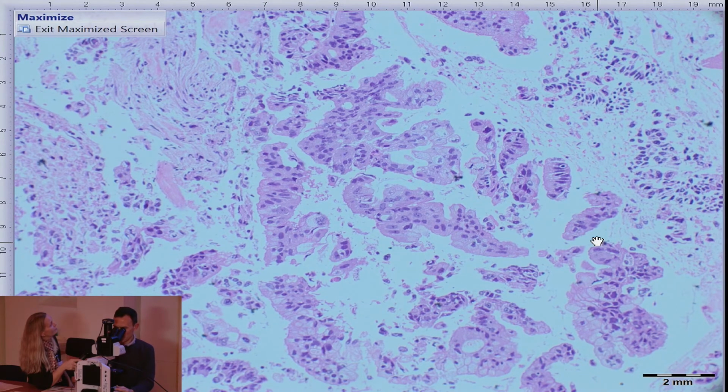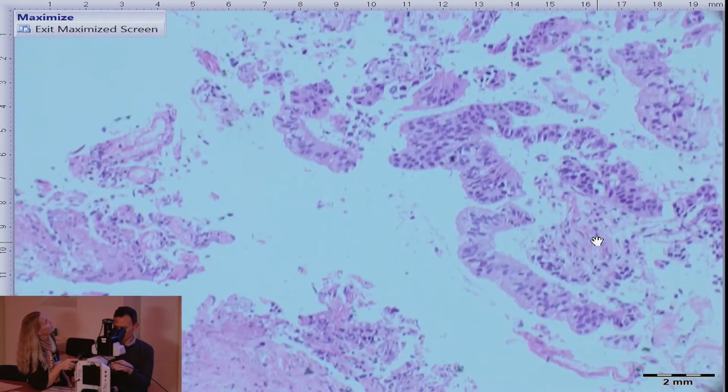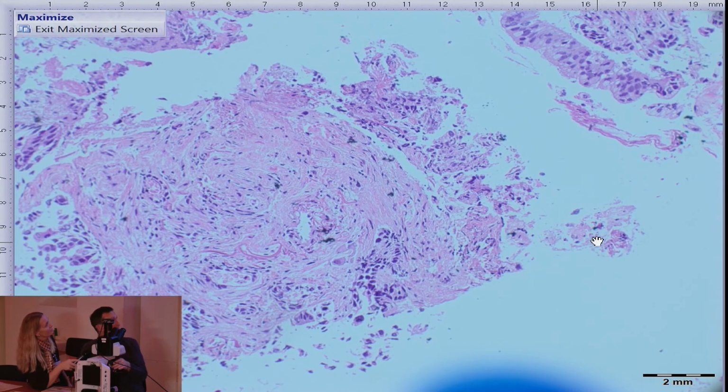The beauty of the cell block histology is that sometimes, besides the epithelium itself, we have cores of stroma, and actually the diagnostic criterion for malignancy is stromal invasion, and stromal invasion is what we have in a tissue fragment like this. It's a stromal fragment with invasive growth of neoplastic malignant tumor cells. So from a histological point of view, this is PDAC. This is pancreatic ductal adenocarcinoma.